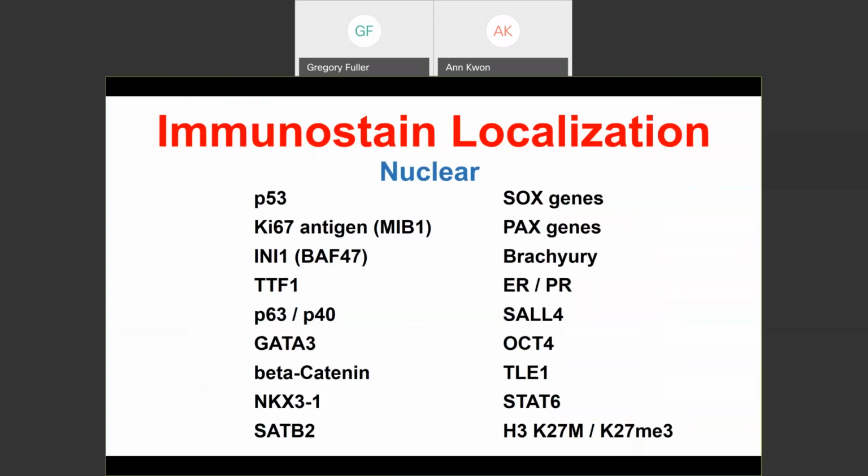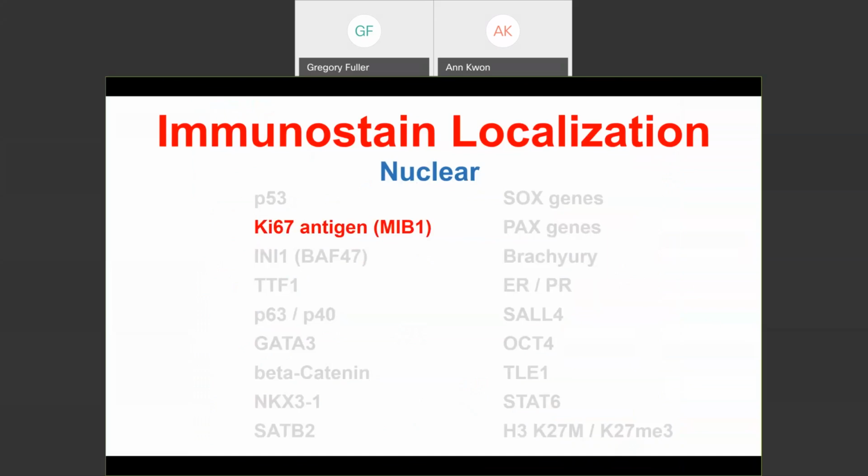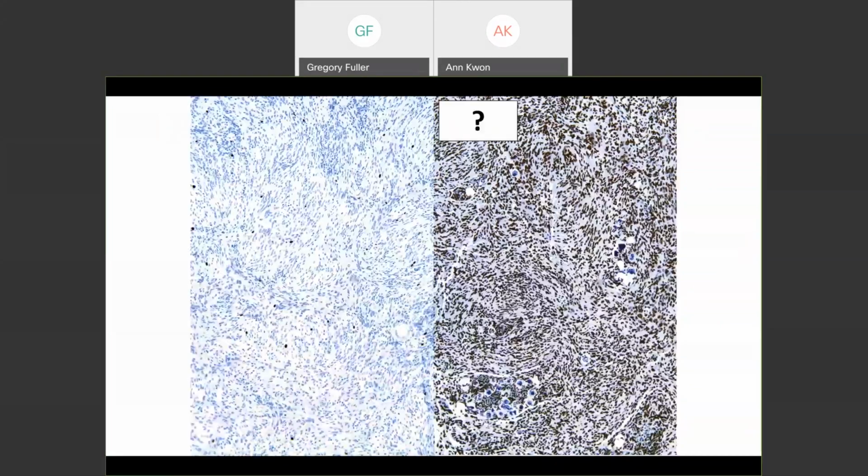What do you think? Let's go back to our list. Do you think it might be on this list? All right, there's the Ki67. We already awarded that to the one on the left because we know it's a WHO grade 1, low mitoses. That's going to be the Ki. All right, what is this guy? How about progesterone receptor? Well, two things. Number one, this would really be strong and diffuse for PR. Definitely many meningiomas, not all, a percentage, I don't know, 20%, 30% show PR. ER? No. Not estrogen receptor, PR, absolutely.